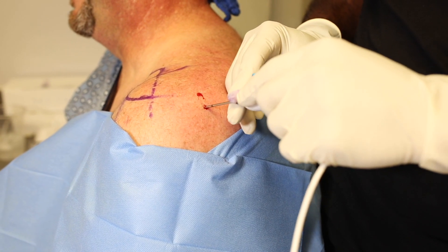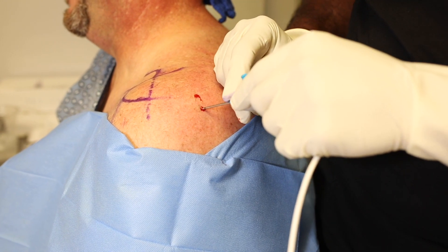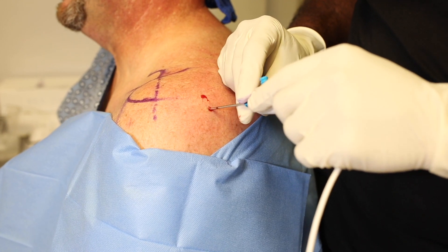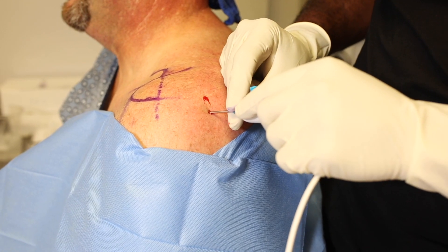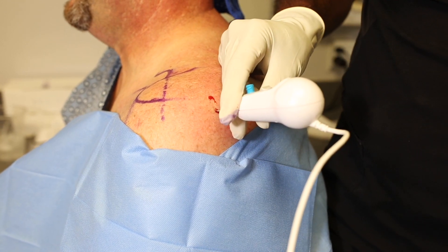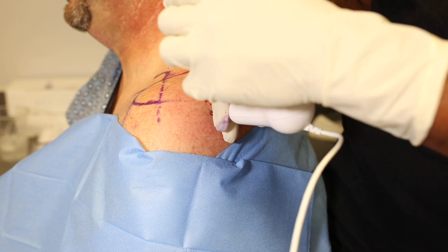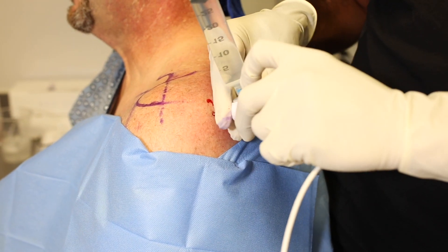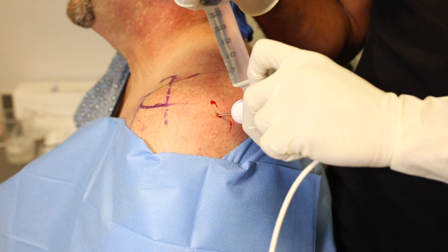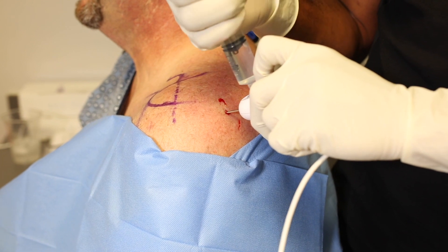After giving the local anesthetic time to set up, we can enter the joint along the same line as the spinal needle using the MyEye2 needle arthroscopy unit. We know our depth, and if necessary we can even mark our depth on the MyEye2 so we know when to expect to pop through the posterior capsule. Once we're into the joint, we retract the protective outer sheath of the needle and use normal saline to establish visualization and start the procedure.